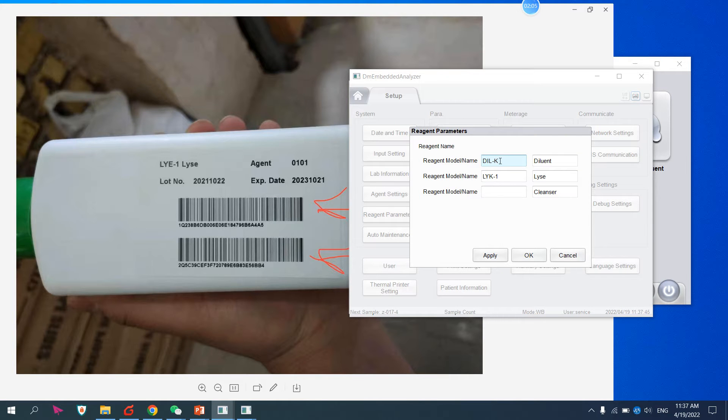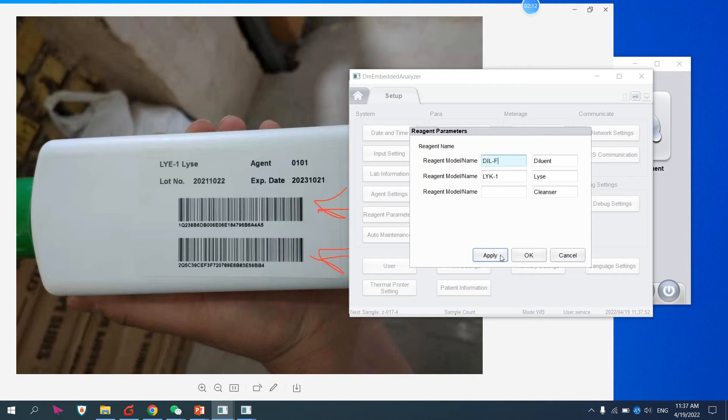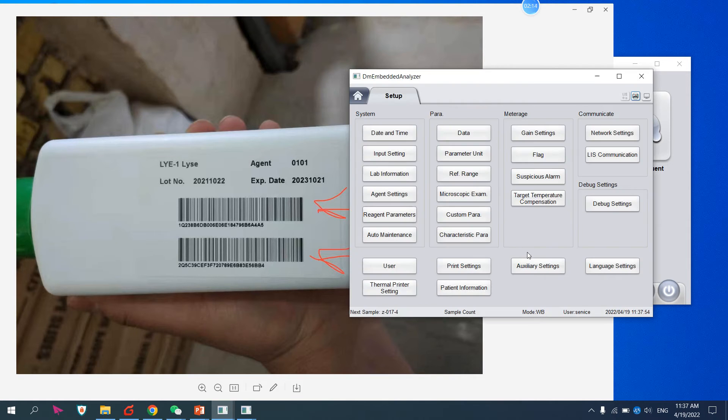For example, the diluent K, I want to replace with F. Apply, okay. Now it will show me.